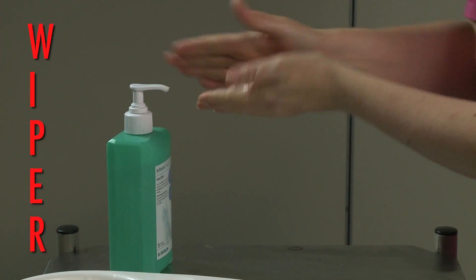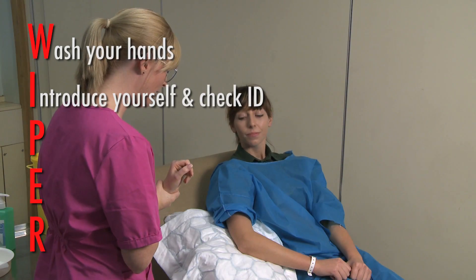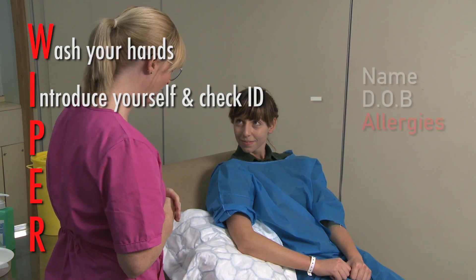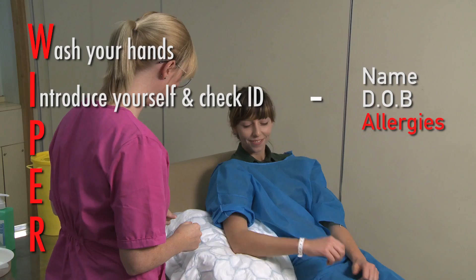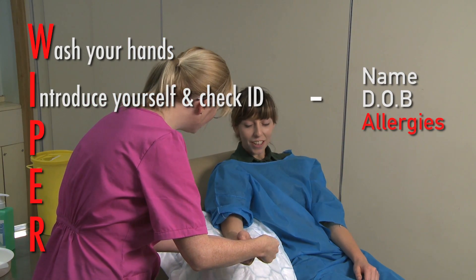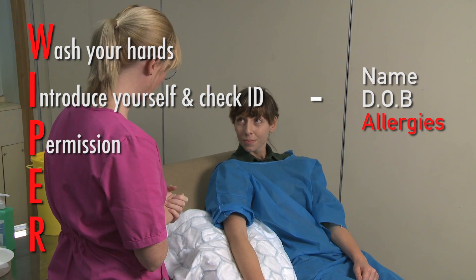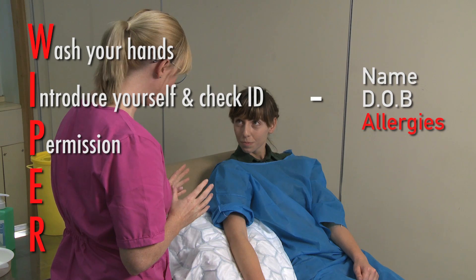To begin the procedure, wash your hands, introduce yourself to the patient, stating your name and role. Ask the patient to confirm their name and date of birth, and confirm if they have any allergies. Ensure you check all of these details on their hospital name band. Seek permission to carry out the procedure from the patient, making sure that you have fully explained the procedure and the reasons for doing it.